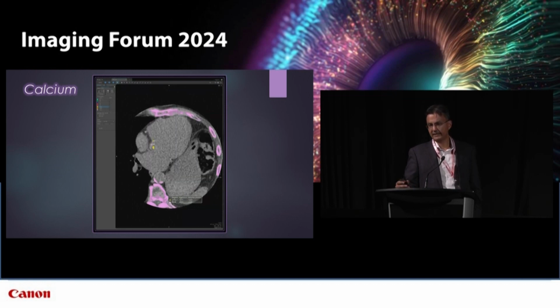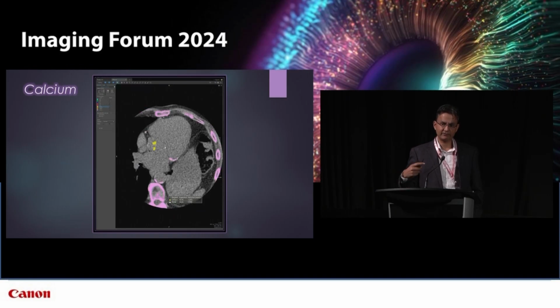That could be problematic if you're trying to segment out only the valvular calcification, which is what's going to drive that threshold, that quantitative number that they need to make the management decision. So you'll notice how that tool is not only picking up the valvular calcification in and out of plane in the z-axis, but it's also avoiding the sinus calcification and the coronary calcification.